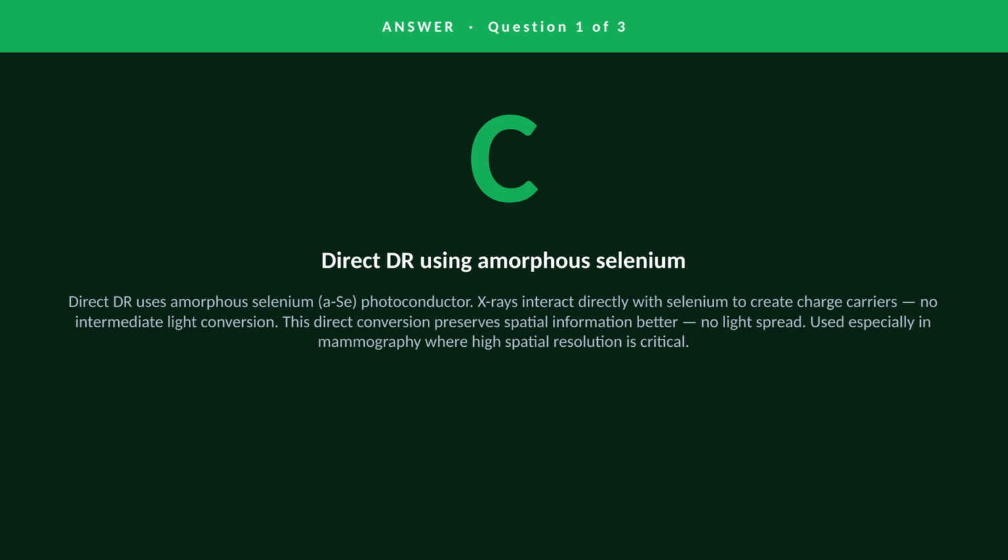This direct conversion preserves spatial information better than indirect systems, because there is no lateral light spread. It is used particularly in mammography where high spatial resolution is critical.